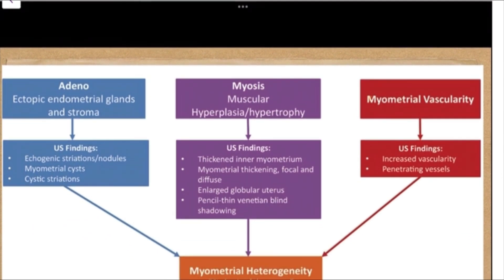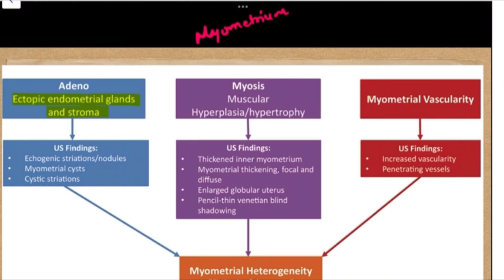In adenomyosis, the endometrial glands are actually in an ectopic position — within the myometrium. If we break the term down: 'adeno' means ectopic endometrial glands and stroma. Because of this, what we see on ultrasound are the echogenic striations, nodules, myometrial cysts, and cystic striations.